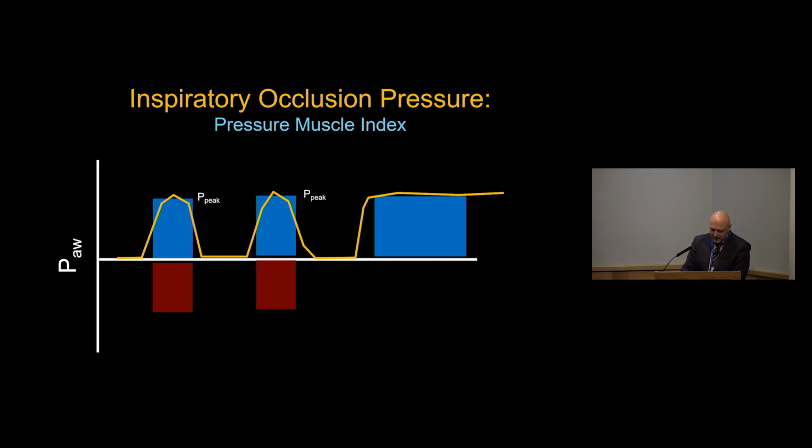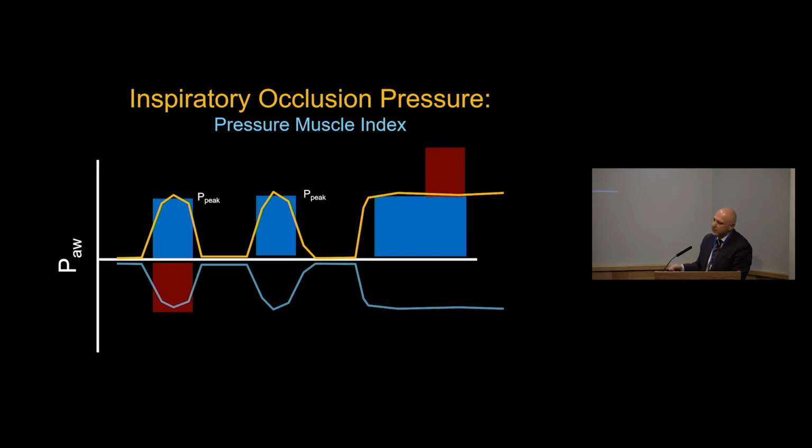Now, the interesting thing about this plateau pressure is that during a plateau pressure, there is a relaxation of the muscles, and this pressure, which was first negative, is going to move and become positive and will become visible. I'm sorry about the colors, looks better over there. But essentially, you've got now a plateau pressure that is higher than the peak pressure, yeah?